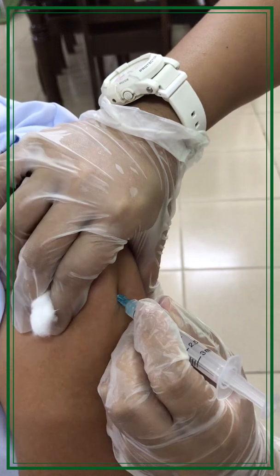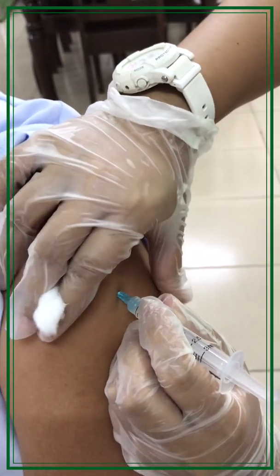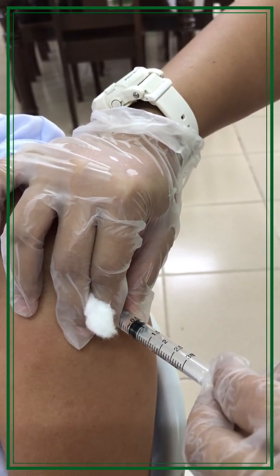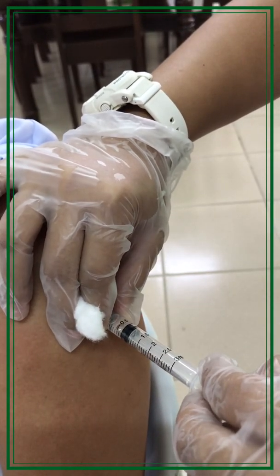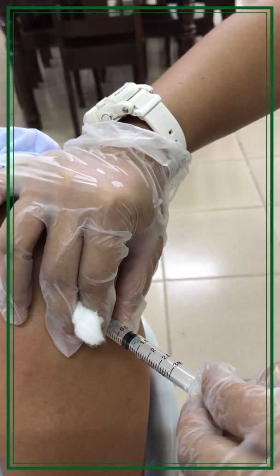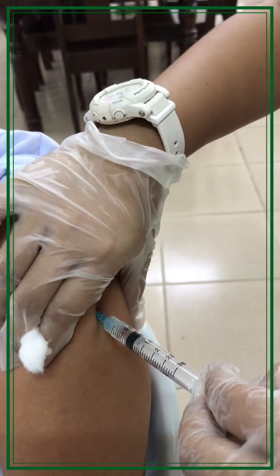Stabilize the syringe and aspirate by pulling back on the plunger with the dominant hand. If blood appears, withdraw and discard the syringe and prepare a new injection. If blood does not appear, inject the medication steadily and slowly.